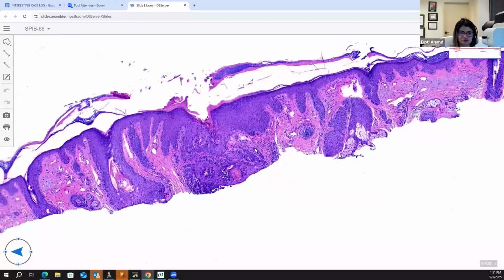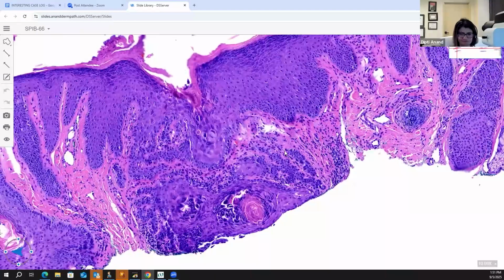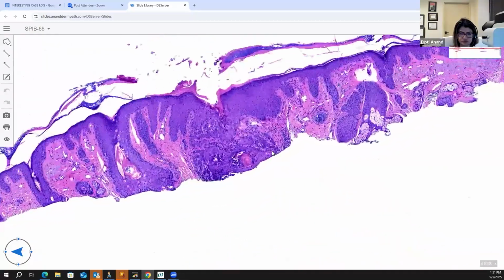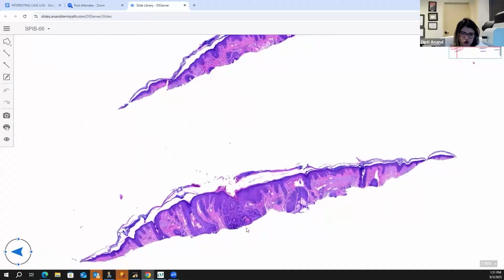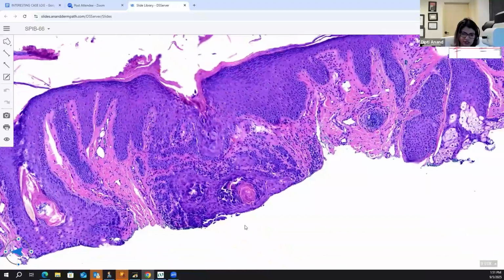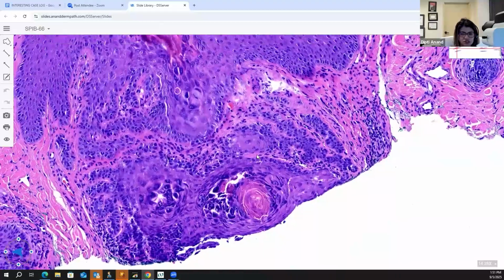What is this? A warty dyskeratoma. Yeah. You see how it's a solitary lesion on the background of what they probably thought was a skin cancer. And you see again how the endophytic nodule is cut off at the base. That's because it's very endophytic. And it has got beautiful acantholysis with dyskeratosis with corps ronds and grains. So this is warty dyskeratoma. Great job, guys.